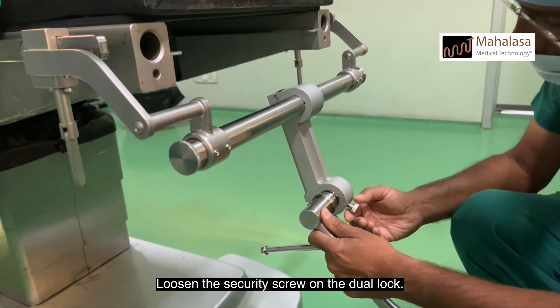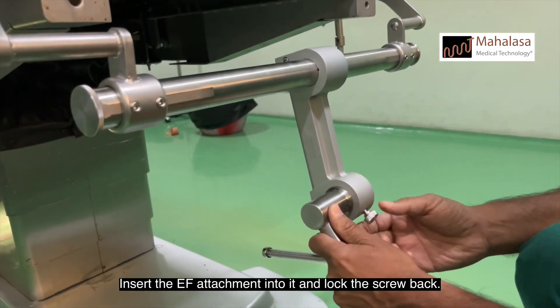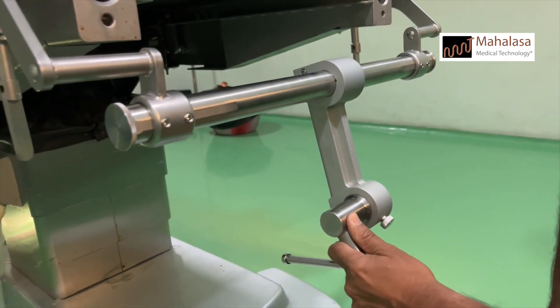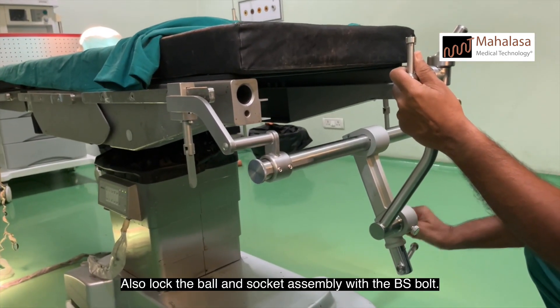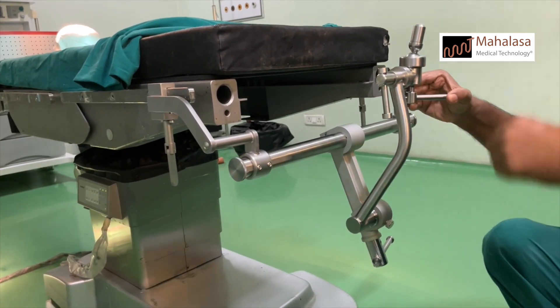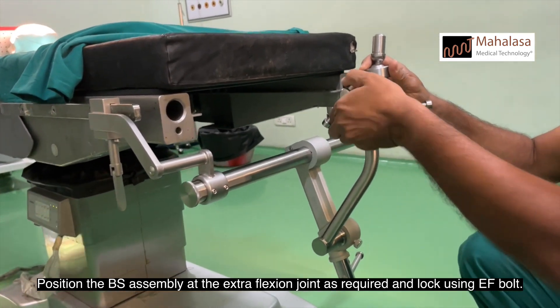Loosen the security screw on the dual lock, insert the EF attachment into it, and lock the screw back. Position the assembly as required and lock the dual lock bolt. Lock the ball and socket assembly with the BS bolt. Position the BS assembly at the extra flexion joint as required and lock using the EF bolt.